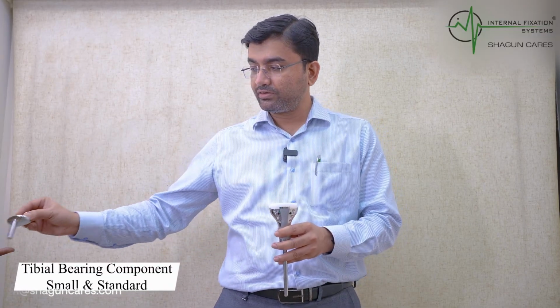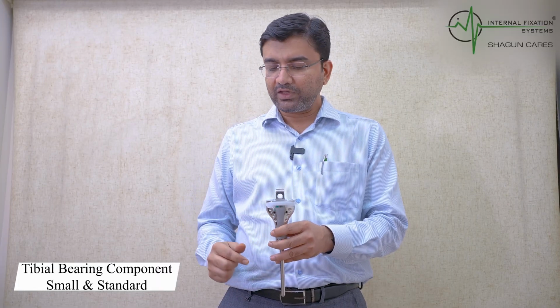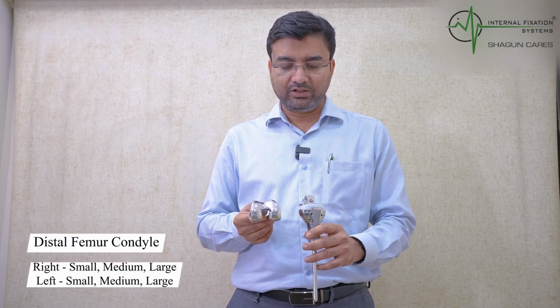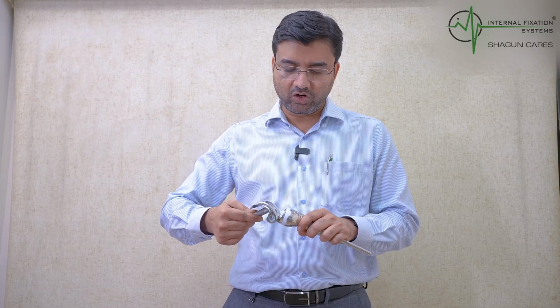Now from here comes your upper tibia part, in which the next component is your rotating base plate, and then your femoral condyle. So this is your femoral condyle, where we are going to insert this and lock it.